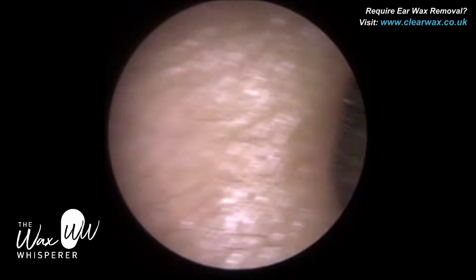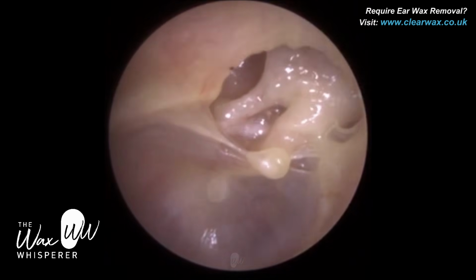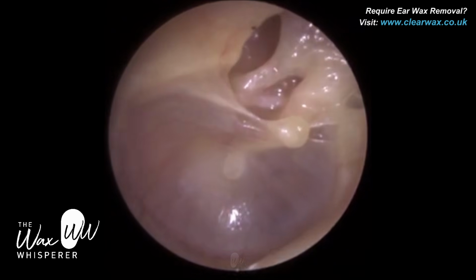This procedure is of a patient who attended with a cholesteatoma. Now, this is the patient's right ear. We didn't perform any treatment per se, but you can just see the top part of the eardrum. It looks abnormal, and I'm going to come back to that in a moment.